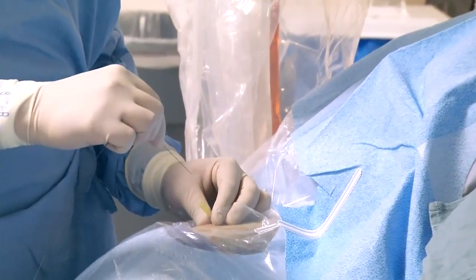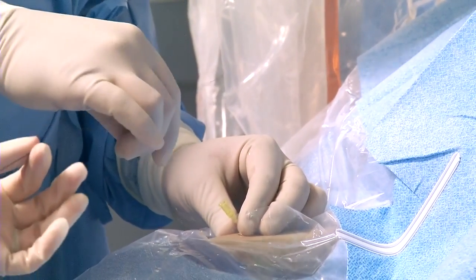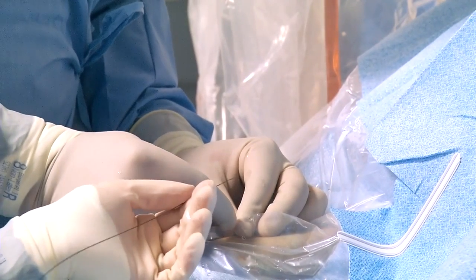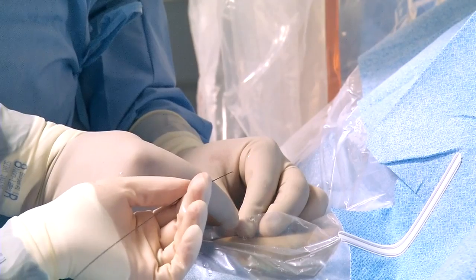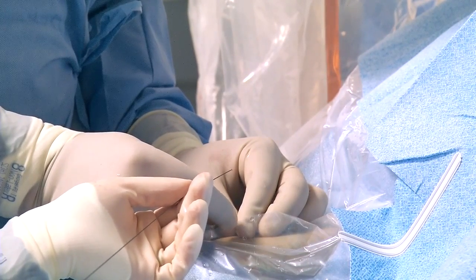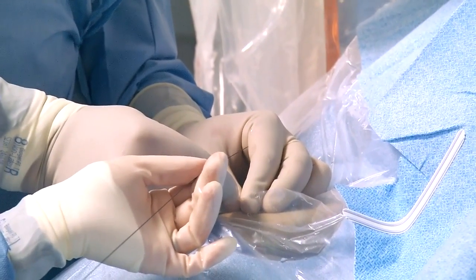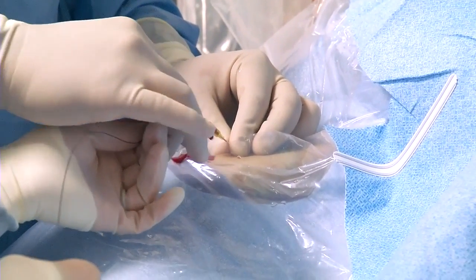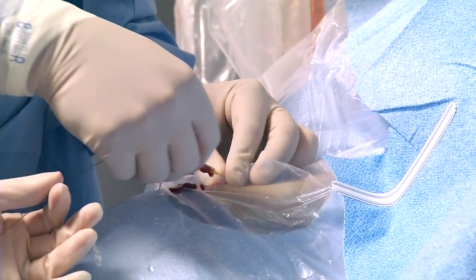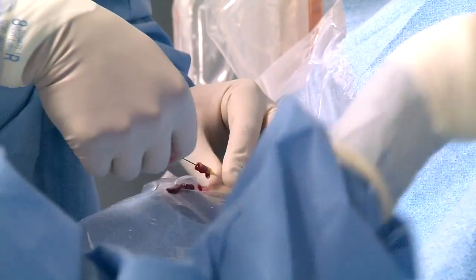The wire, you can just hold right there with the other hand, close to it. So we're going to slowly pull back until we see pulsatile flow. Now we see nice pulsatile flow. Advance the wire. This is going smoothly.